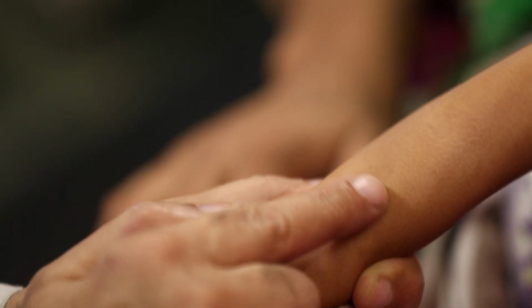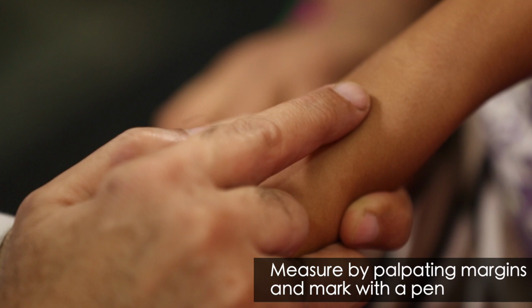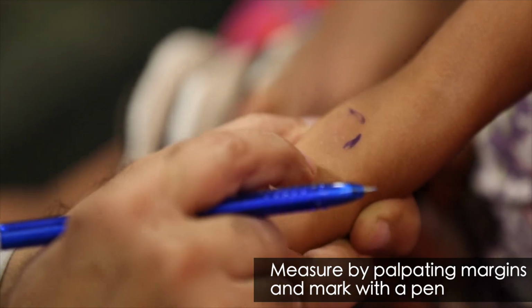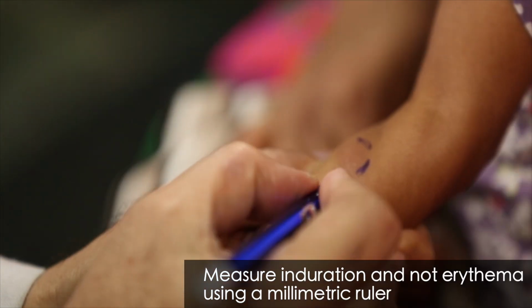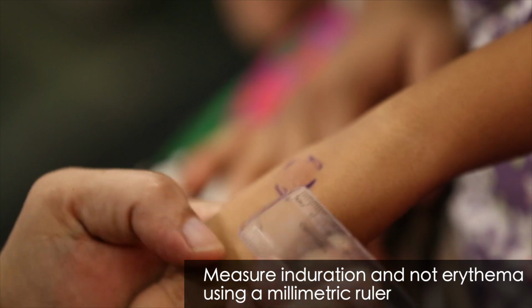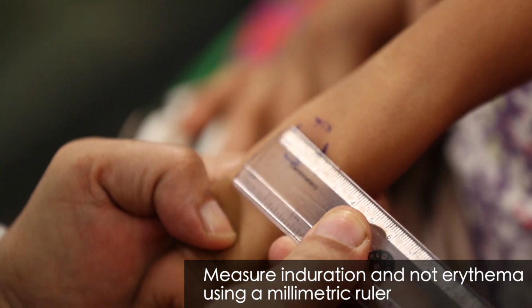Here, we gently stroke the area around the injection site to identify any raised margins. The identified raised margins are then marked with a pen. The diameter of the indurated area should be measured across the forearm, that is, perpendicular to the long axis. With a millimetric ruler, we measure only induration and not erythema.